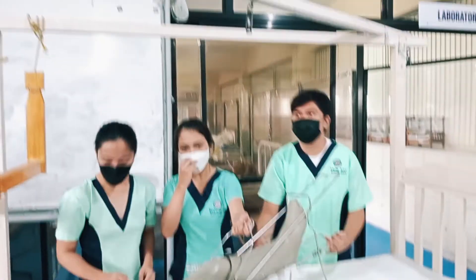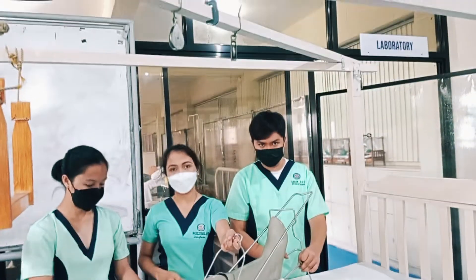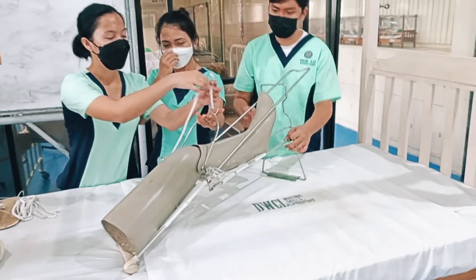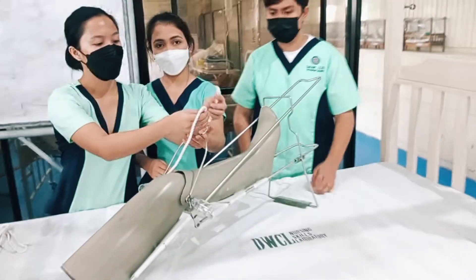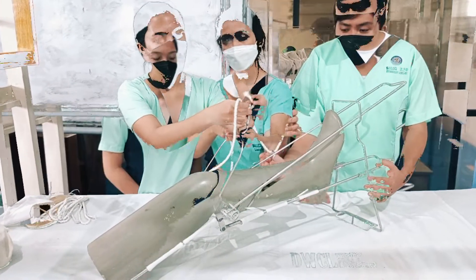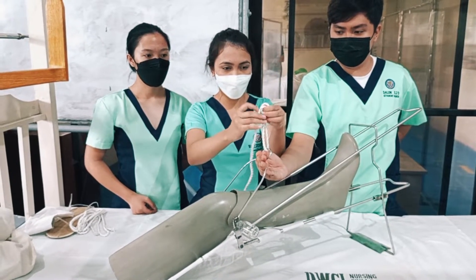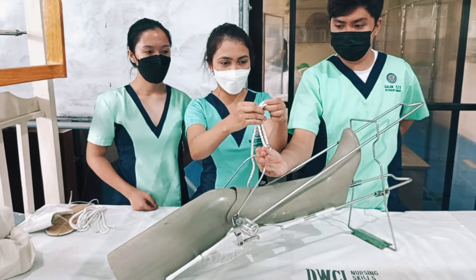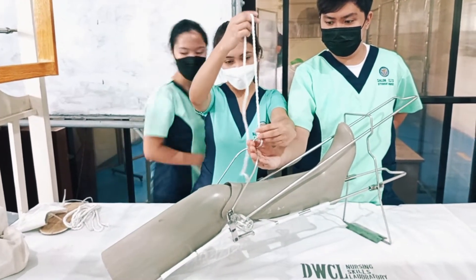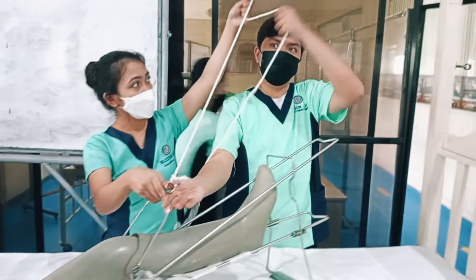Ensure the alignment of the deformity or the affected part at the pulley. Then tie the long rope, or the traction rope, to the stirrup pin holder using a cleat knot. Pass it through the third pulley.